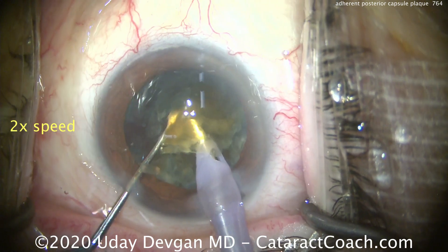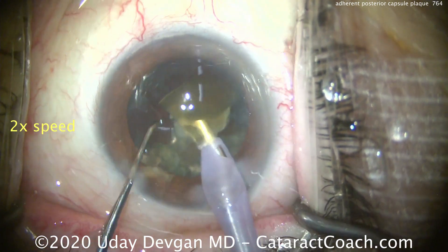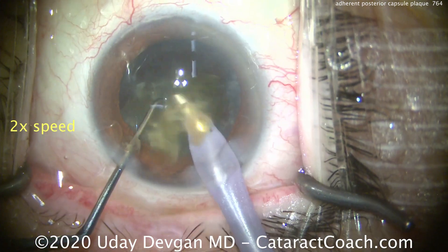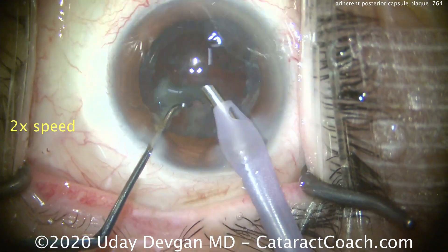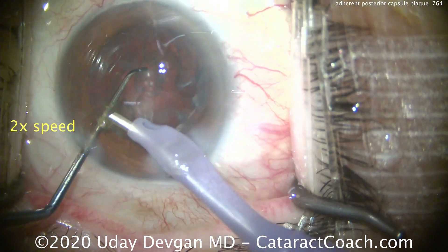That looks great. Here's another good chop, bringing that piece to the tip and emulsifying it down. If you end up using a lot of phaco power, it's okay to stop in the middle of nucleus removal and recoat the endothelium with more dispersive viscoelastic. In this case, though, we're pretty careful and we should be okay.